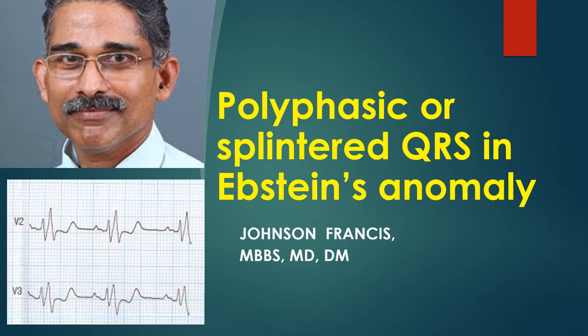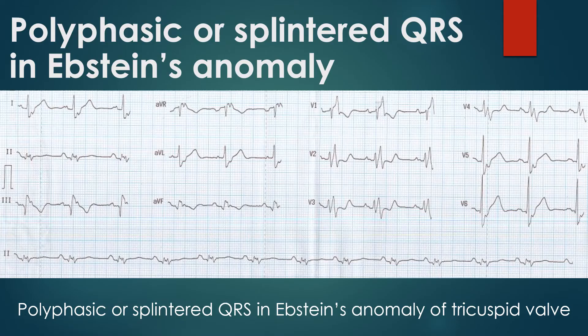Polyphasic or splintered QRS in Ebstein's anomaly of the tricuspid valve. The ECG shows a right bundle branch block pattern with polyphasic and splintered QRS. Lead V2 shows an RS-RS pattern mimicking right bundle branch block, with multiple small deflections — i.e., splintered QRS. Slurred S-wave in lateral leads also forms part of the RBBB pattern.